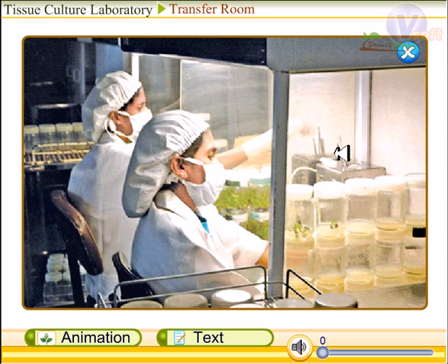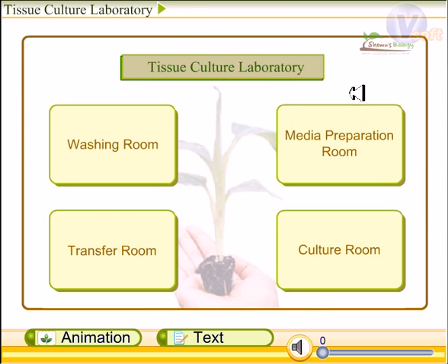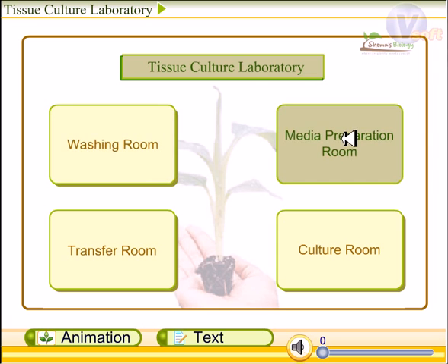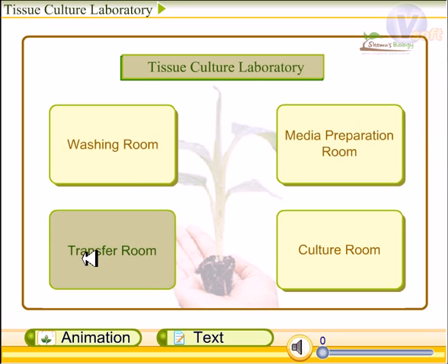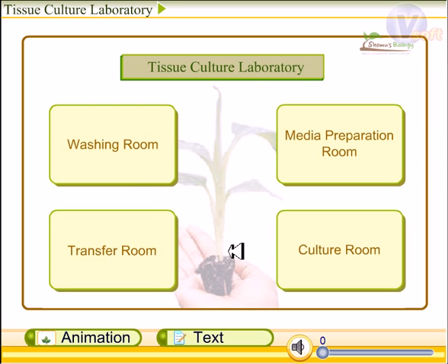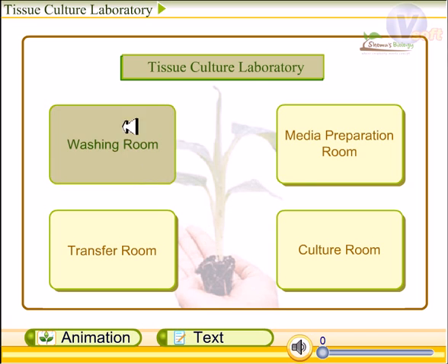One important point: the correct process order is washing room, then media preparation, then transfer room, and then the culture room.